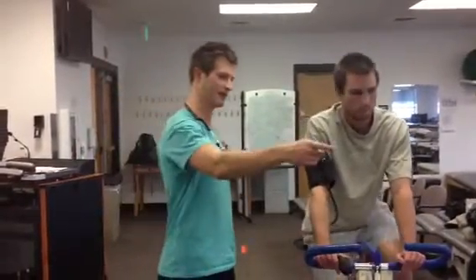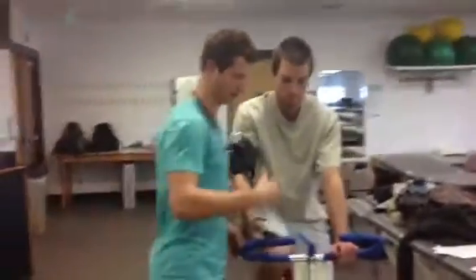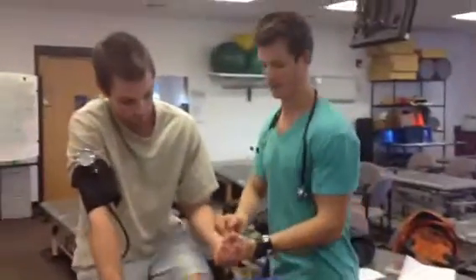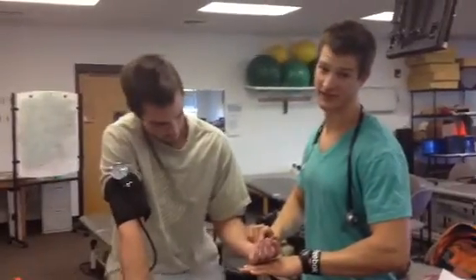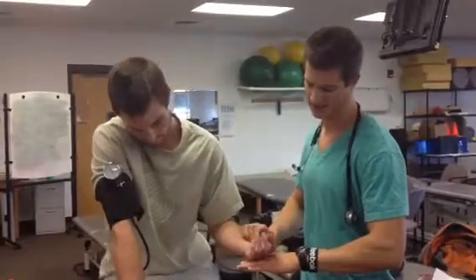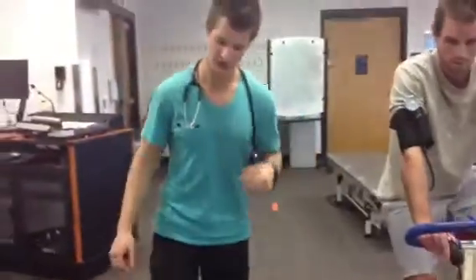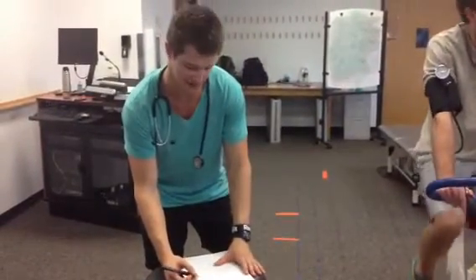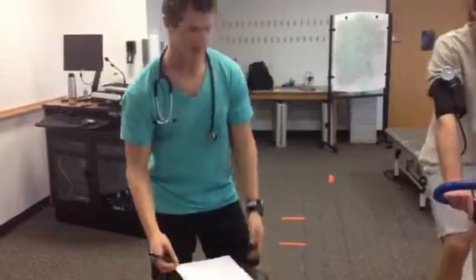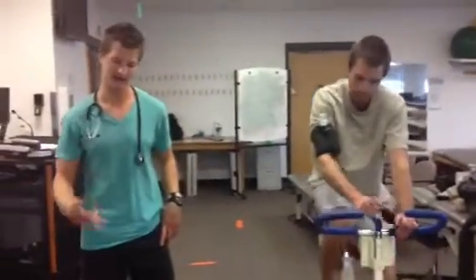So, Denny, how hard do you feel like you're working right now? 13. Okay, I'm going to take heart rate as well. I'm going to measure this for about 10 seconds, then multiply by 6 to be as accurate as possible. Okay. For minute 2, those values were 140 beats per minute for my multiplied-by-6 value, and then an RPE of, you said 13 then? Okay. And we're going to wait, and minute 3, we're going to do those again in addition to blood pressure.